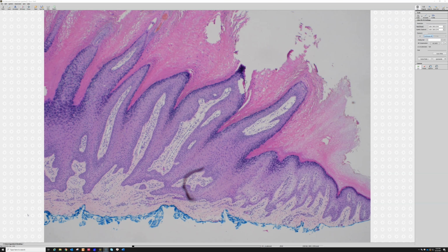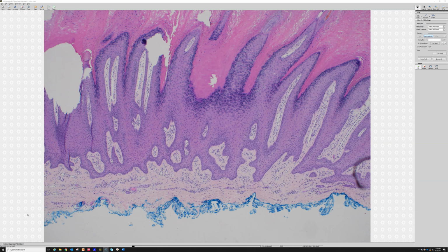So that's totally acceptable and, in fact, relatively common to see. Again, with the in-toeing, not quite as nice and curved as the last case, but look, here's the rete ridges out here pointing down straight. As you get closer to the wart, they start curving in, and here they're going totally sideways, trying to get back to the middle of the wart. I don't know why the rete want to get to the middle of the wart so bad, but it seems like they do.